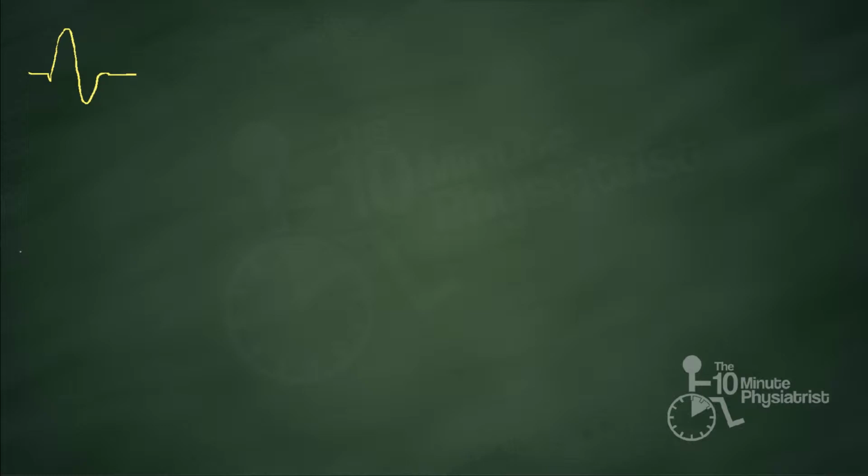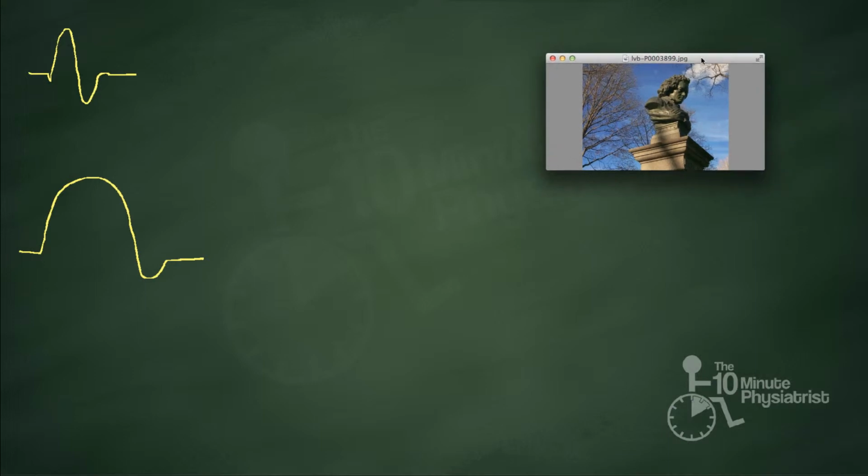The motor nerve action potential looks a little different in that it should not have an initial positive deflection, and generally assumes something like this shape. So there are a few fundamental differences between these two types of potentials. We'll start with a little bit of a seeming digression.